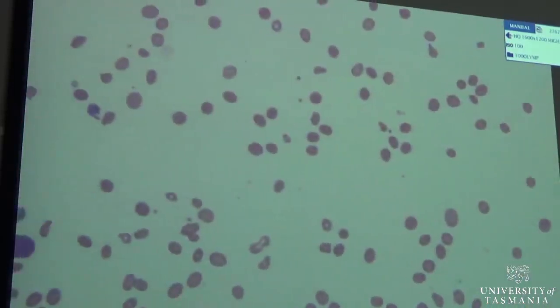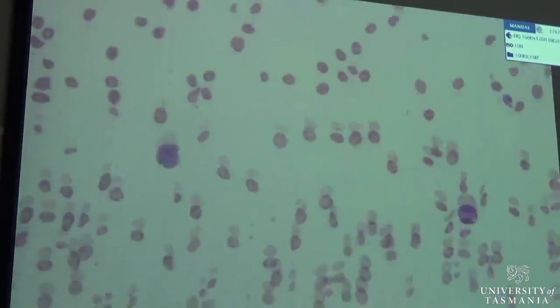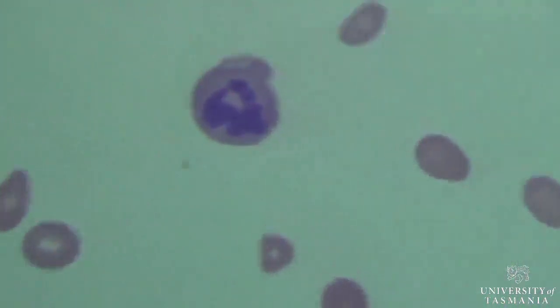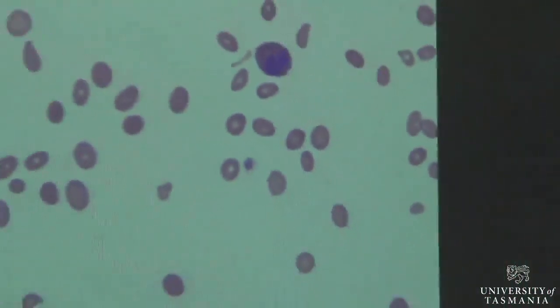The fact that the cells are macrocytic, that they're oval, and that you're seeing that teardrop poikilocytosis. And the other thing that everybody picked up was the fact that many of the neutrophils were hypersegmented. There we go, there's a beauty. So there you go, in that field you've actually got a band form and a hypersegmented neutrophil. And again, that's not uncommon to see the band forms in this form of condition, which is a megaloblastic anemia, because you have got disrupted hematopoiesis.